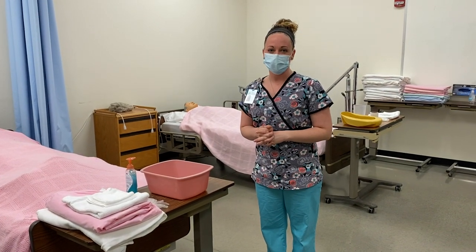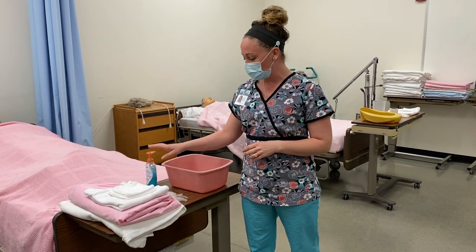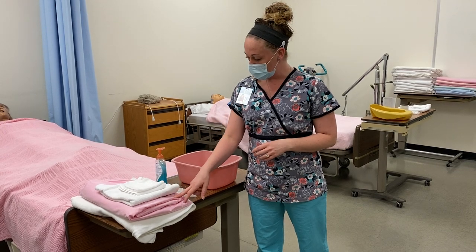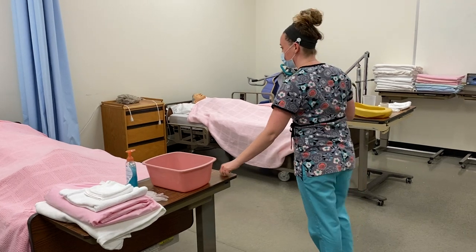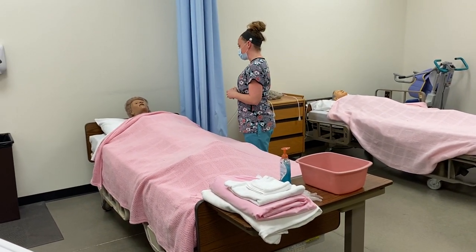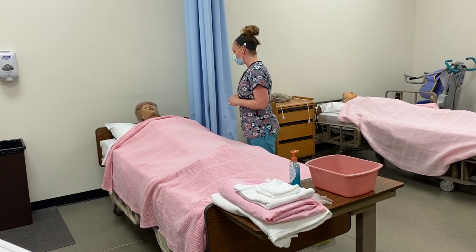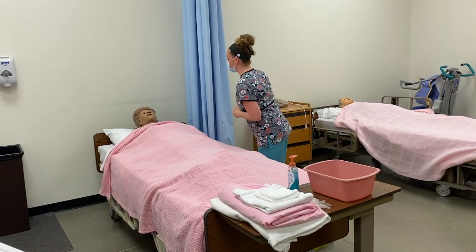We will be performing catheter care. For this skill you need your wash basin, your soap, a pair of gloves, two washcloths, a towel, a bath blanket, and a cloth pad. Good morning Mrs. Jones, my name is Mackenzie, I'm going to be your STNA today. I'm here to perform your catheter care, but first I need to perform my hand hygiene and gather my supplies, so I'll be right back.